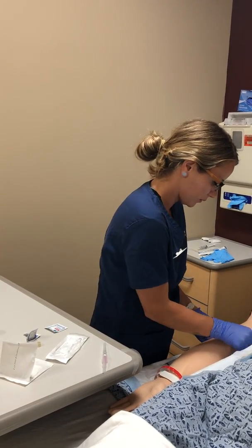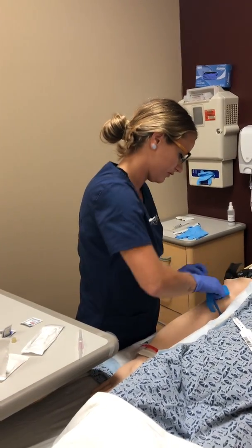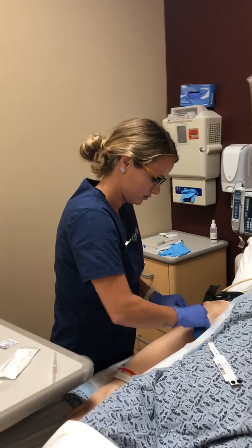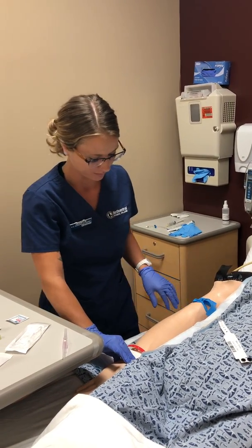Okay, so I'm going to apply the tourniquet. The important thing to know about tourniquets is don't leave them on for more than 2 minutes. Check the radial pulse. She's got a nice good pulse here, so it's not occluded.